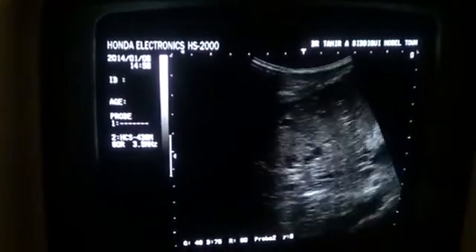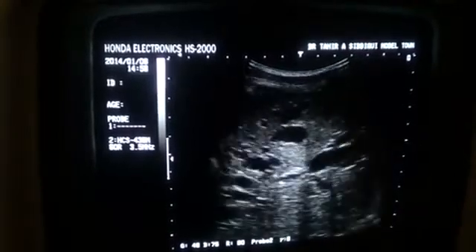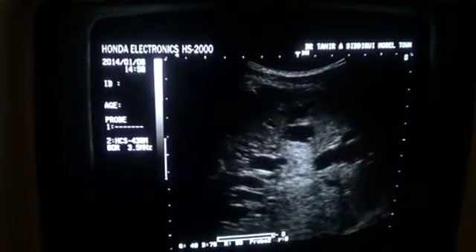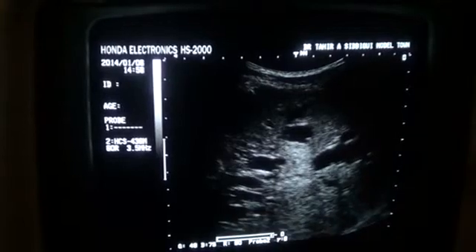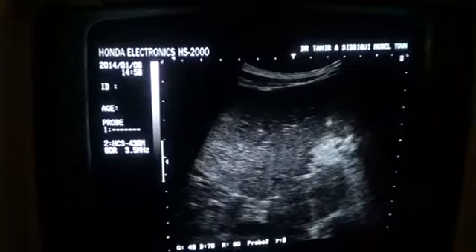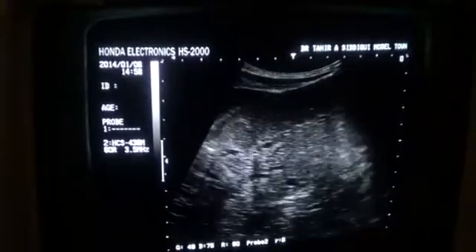In both lobes — this is the left lobe of the liver. You can see the tubular structures, the dilated ducts — tubular dilated intrahepatic bile ducts. I have magnified the view, so it appears more dilated. One interesting thing to note is that the ducts surround the portal vein radicals in Caroli's disease.